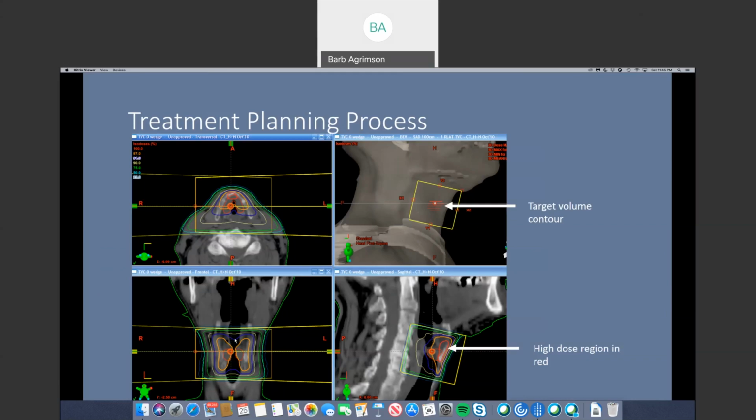In this image, the lines displayed are termed isodose lines. So those different colors, the red, the orange, the blue, the yellow, the green, those are all isodose lines representing different dose levels. In the upper left-hand side, you'll see some numbers, 100, 97, 94, 90, and those correlate with the color of the isodose line, and that's a percentage of the dose.